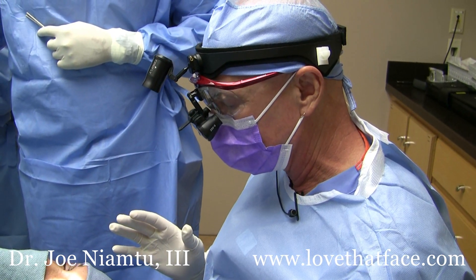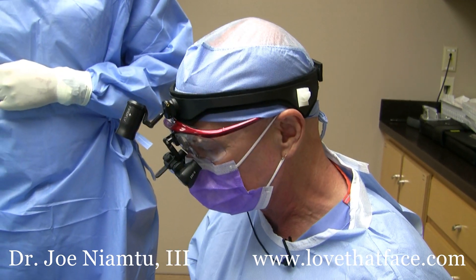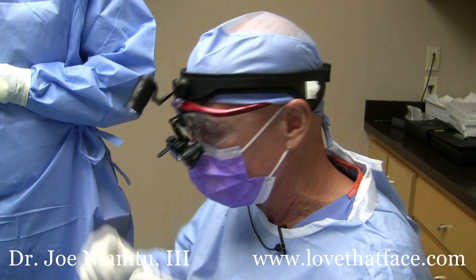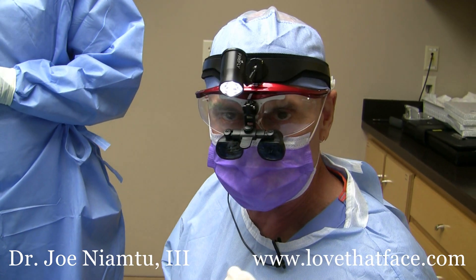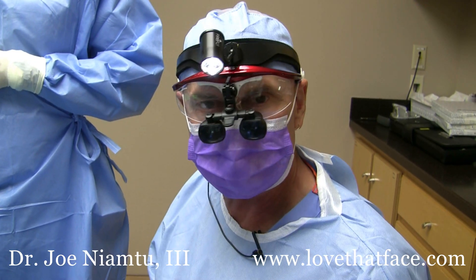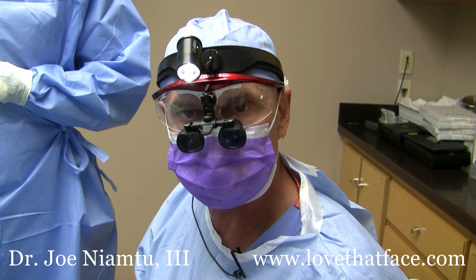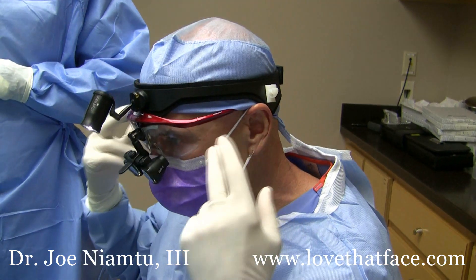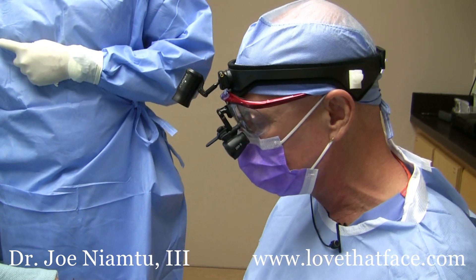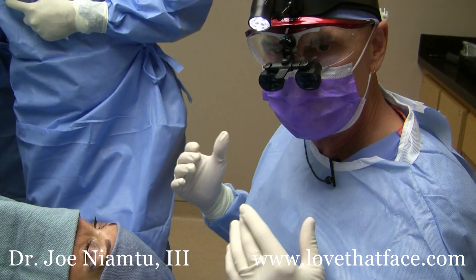One of the great things I like — by the way, these are the Perioptics by Denmat hoagie frames with the loops and eye protectors. If you've looked at my other videos featuring Perioptic equipment, you've seen the magnetic loops and headlight, which are another favorite of mine. But the problem with a headlight mounted on eyeglasses — so you have your loops, your shields, your headlight — it really gets heavy on your nose. We're doing eyelids and a facelift here, but whether you do facial surgery, body surgery, dentistry, or whatever discipline, after a while nasal pressure really starts to hurt and becomes uncomfortable. This very light headband suspends the light effortlessly, and my staff can take this off or change it mid-surgery. The two biggest things I like about this are the intensity and the fact that it's cordless and not resting on my nose.